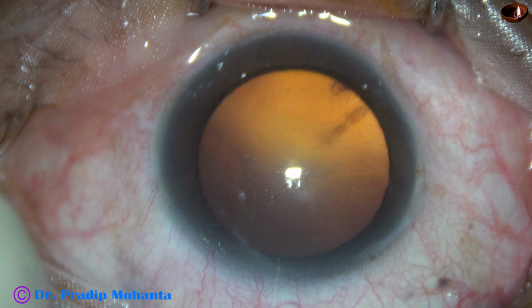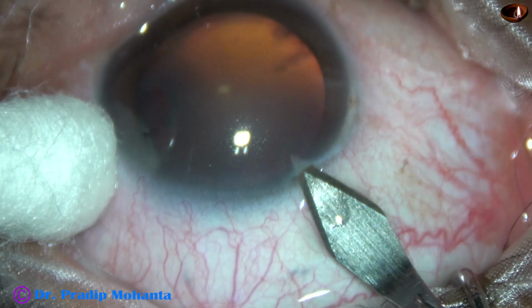This eye, having an axial length of 31 mm, is highly myopic. The selected intraocular lens is a Sensar multipiece of minus 4 diopter. Let us observe this surgery.